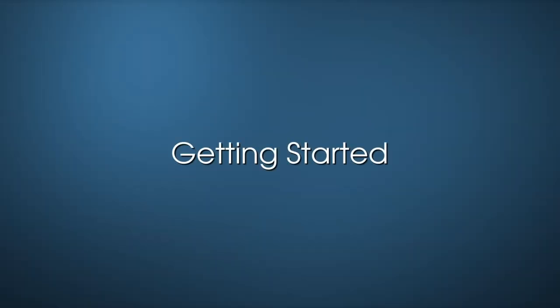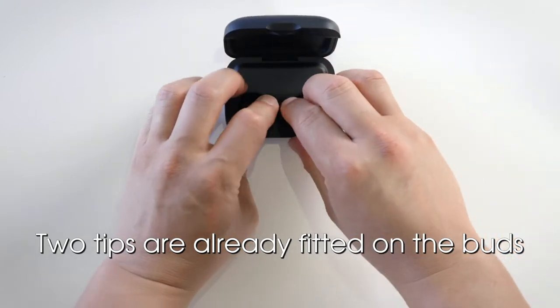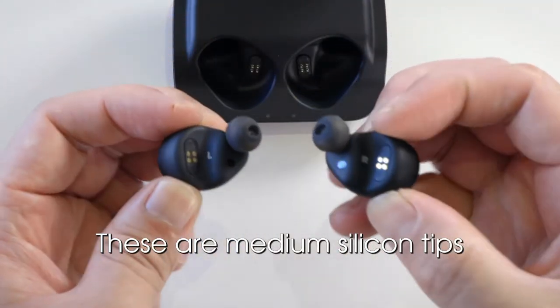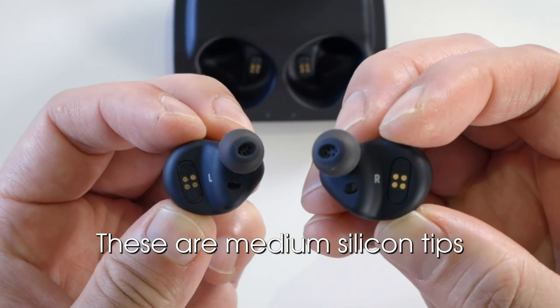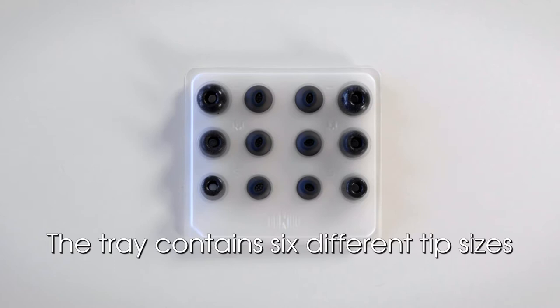Getting started. Your IQbuds come with two tips already fitted on the buds. These are medium silicon tips. It is advised you test a number of different tip sizes to find the best fit for your ears. In the box for your IQbuds, you will find a tray containing six different tip sizes.